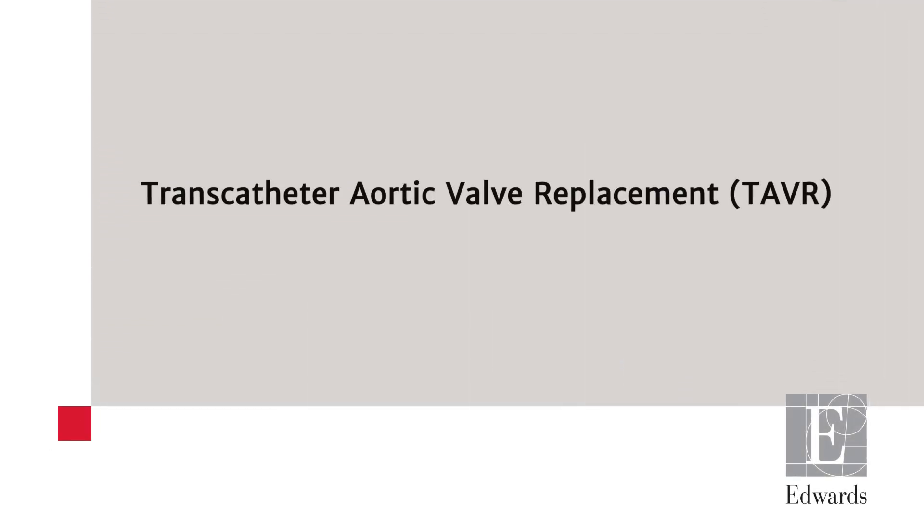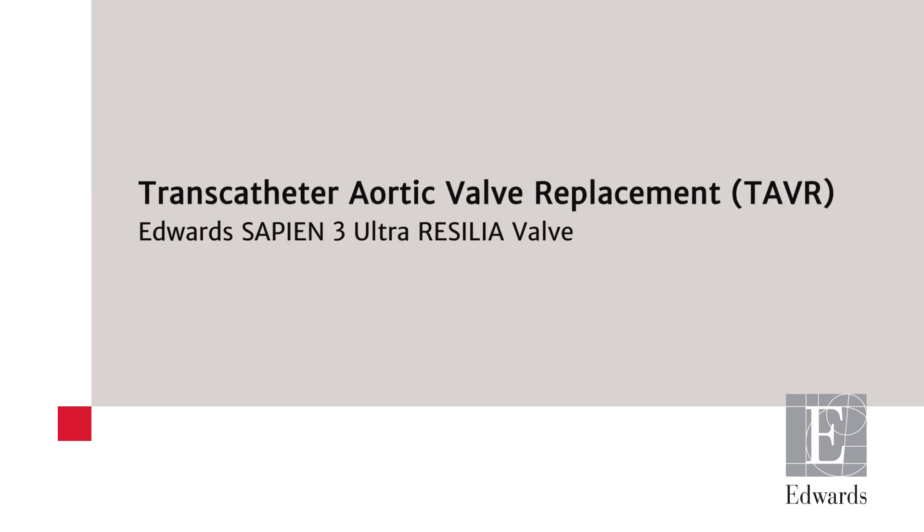This is an animation showing transcatheter aortic valve replacement with the Edwards Sapien III Ultra Resilia Valve.